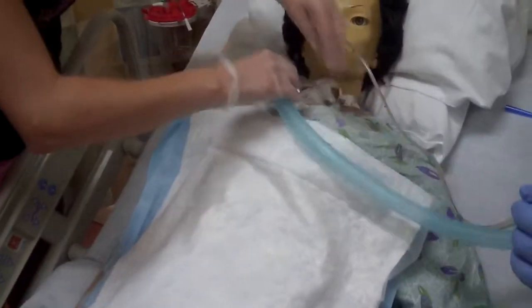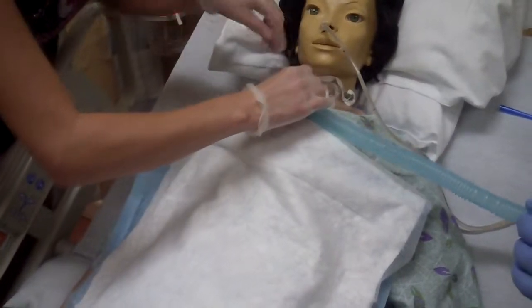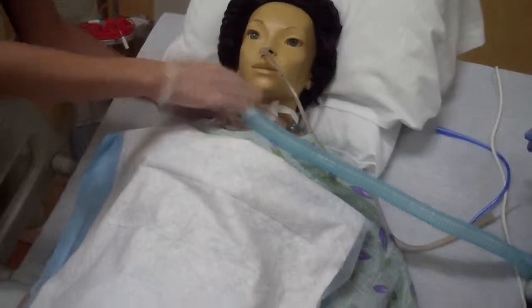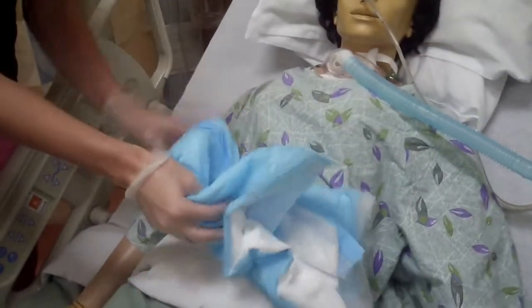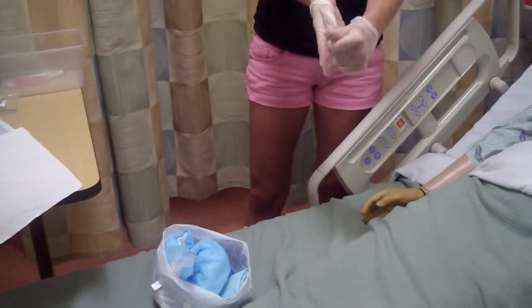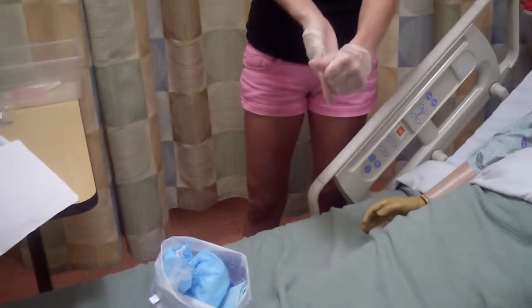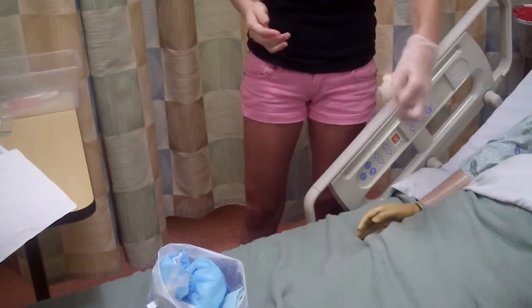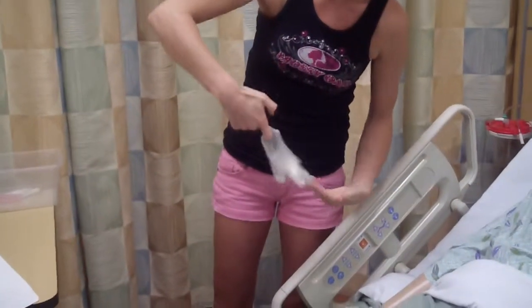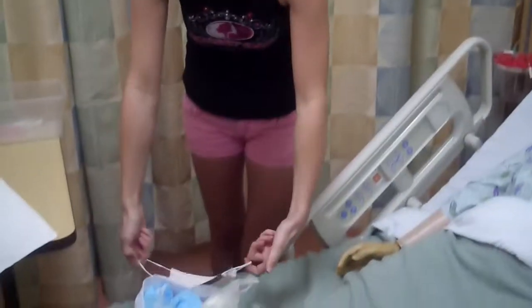Then we are going to replace her oxygen, making sure that it would not be tangled. Remove the absorbent pad, dispose of. Remove our sterile gloves. Throw those away and remove our shield.